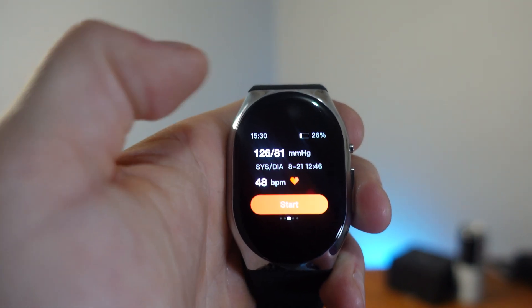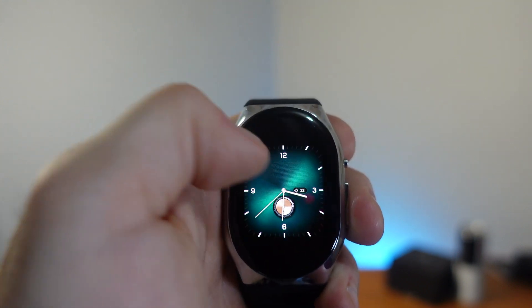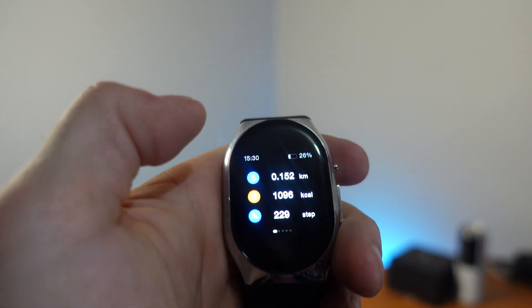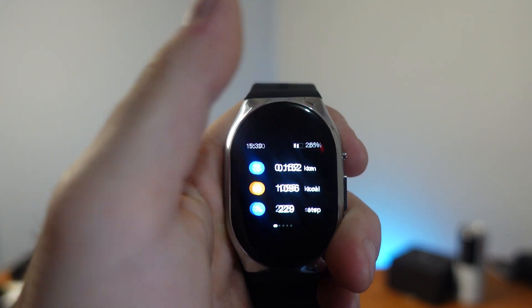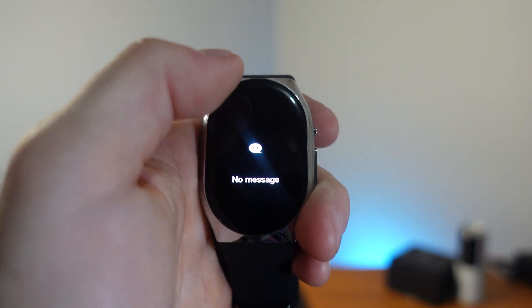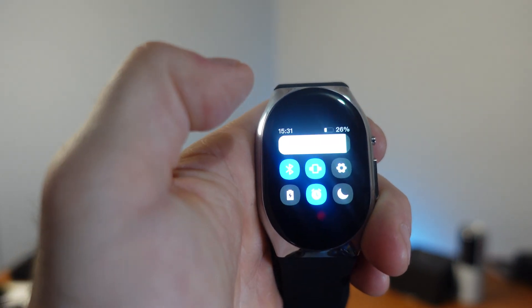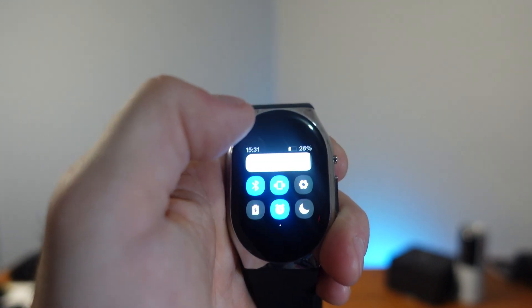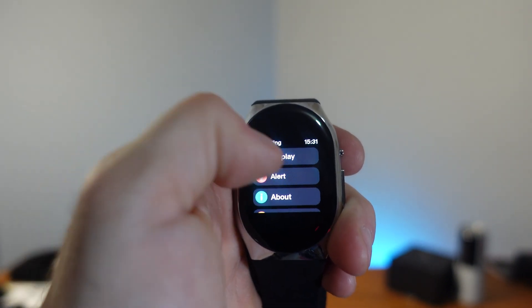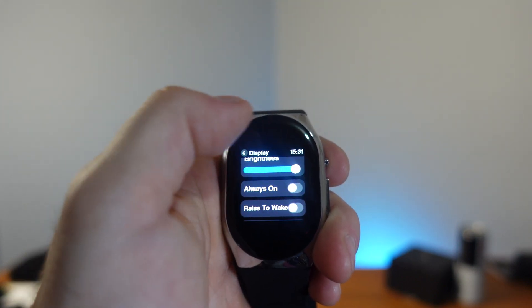Getting into the user interface — swipe right to left to go into blood pressure monitoring, heart rate, and SpO2. Swipe left to right to see all your health metrics. Swipe up to see all your messages — make sure that's enabled in the app. Swipe down for some settings like display and device info.